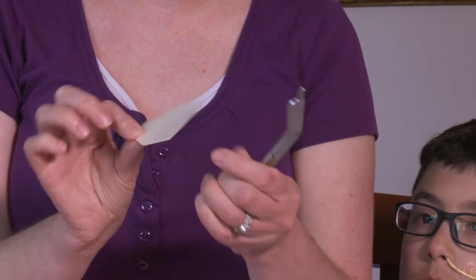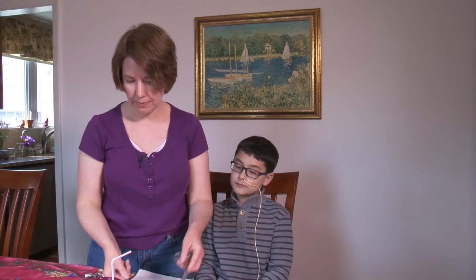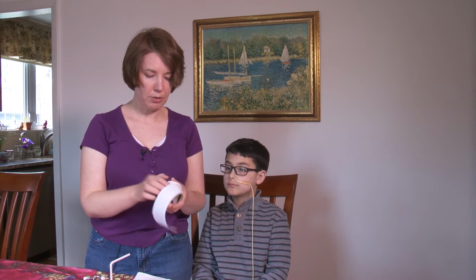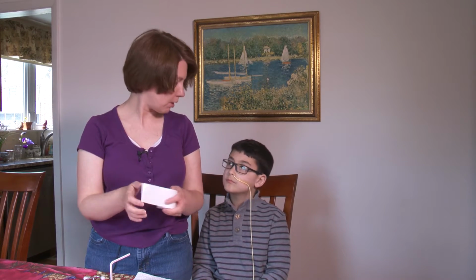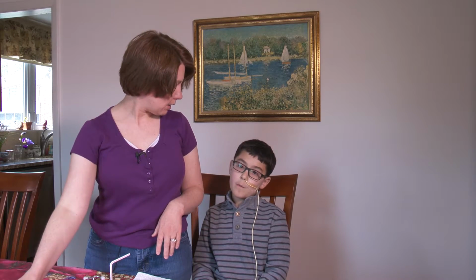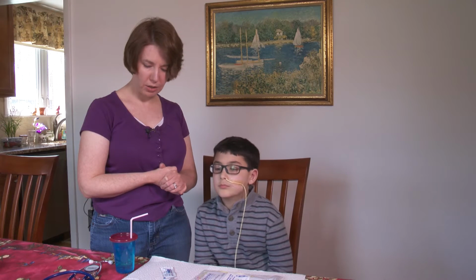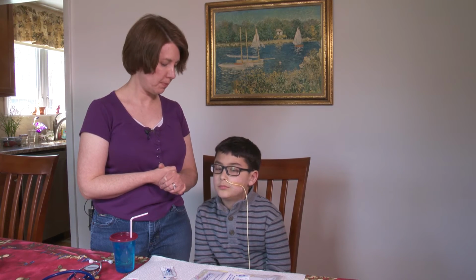When you're cutting your tape, you want to use actual bandage scissors. It makes a much cleaner cut. And the other thing with the tape is some kids like to use a sticker on it to make it look more like they have their face painted, and we did do that for a while, but now Noah said he just prefers to leave it plain. Okay, so why don't we get started and show you how to put in an NG tube.